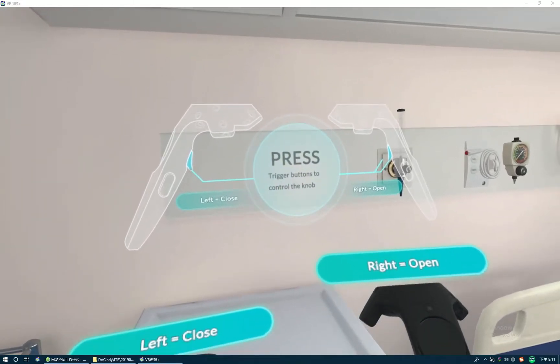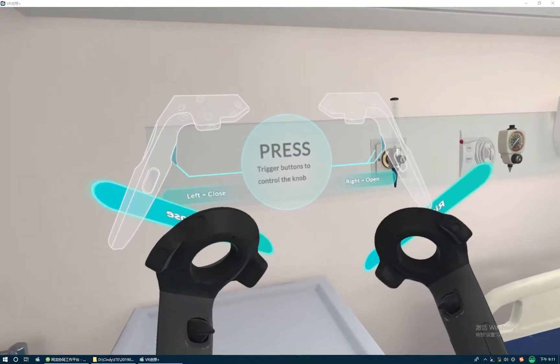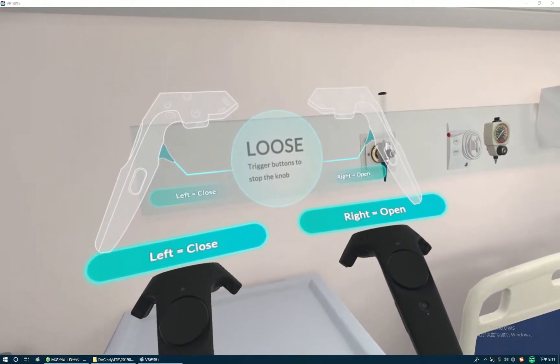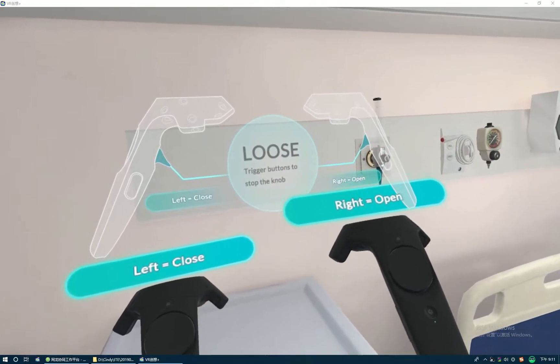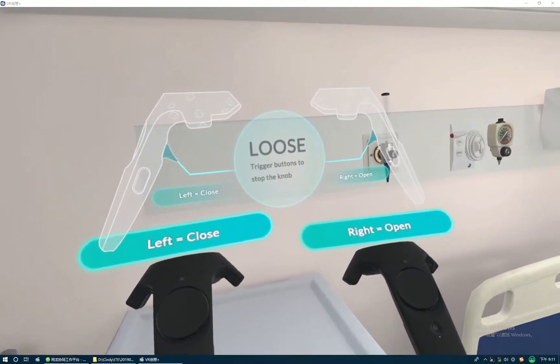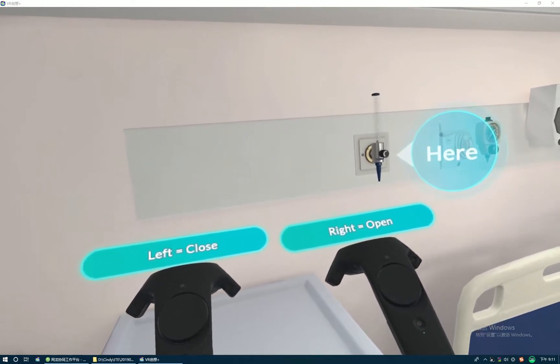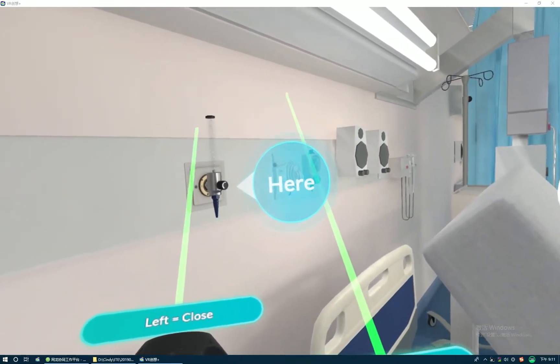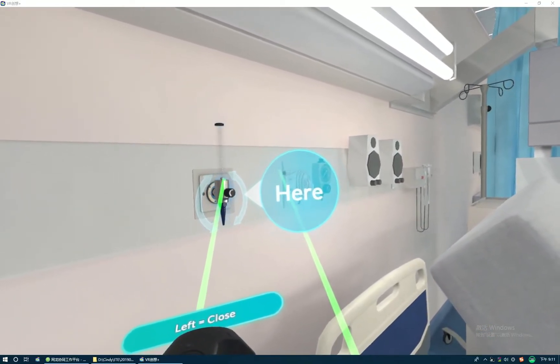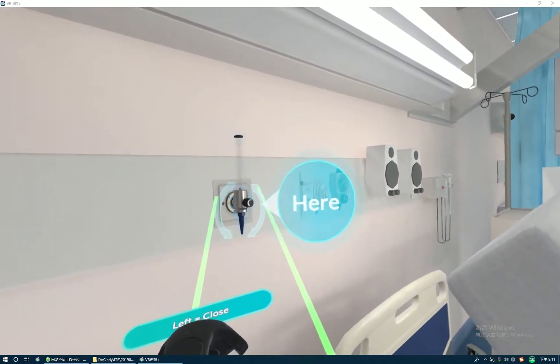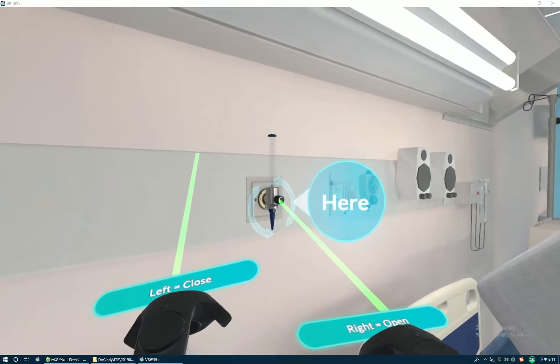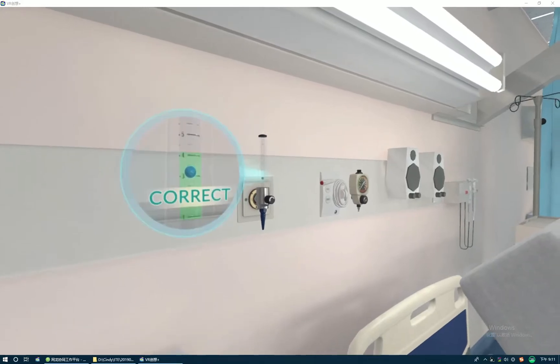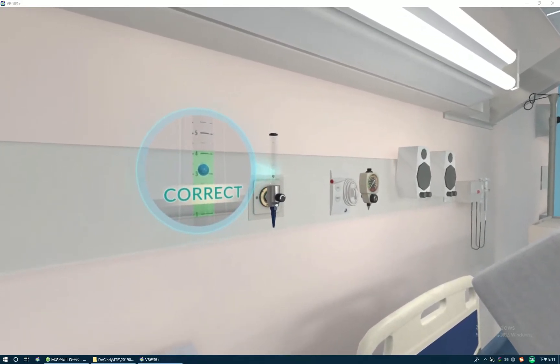Press the trigger button to control the knob. Release the trigger button to stop the knob. Press the right trigger button to open the knob. Press the left trigger button to close the knob. Approach the oxygen flow meter to operate the device. Press the right trigger button to close the knob. Correct! You are doing great!